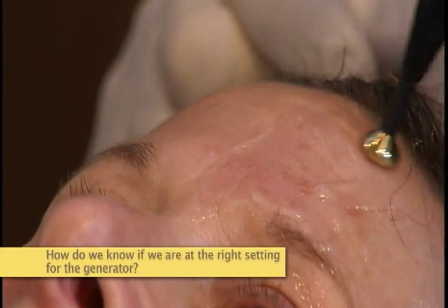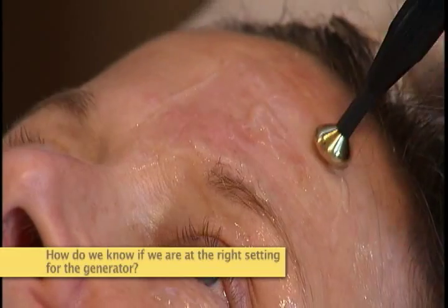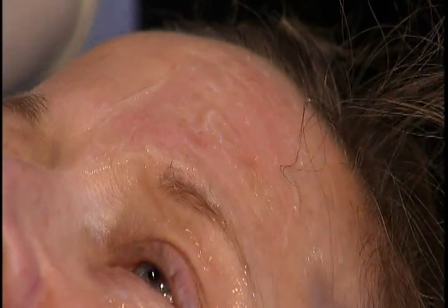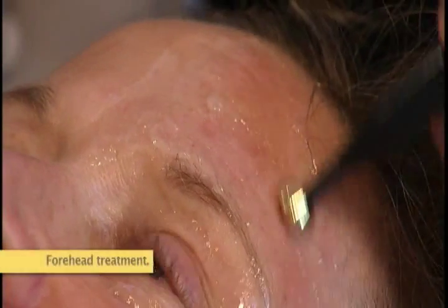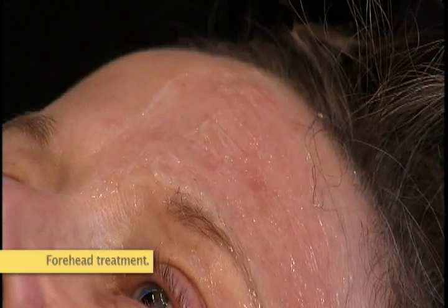Now, how do we know if we're at the right setting? The first thing is that she's not saying, oh my God, that's hot. If you were at some super high setting relative to what she was going to tolerate, just making contact and starting to swirl, she'd complain. So we know we're not there. I use long parallel strokes along the brow. I might use small swirls as I go up in the forehead. I go parallel and perpendicular to the forehead lines. And again, a generous amount of gel.